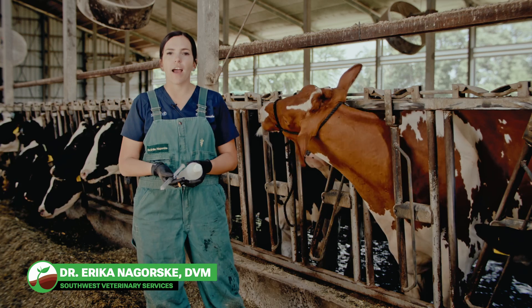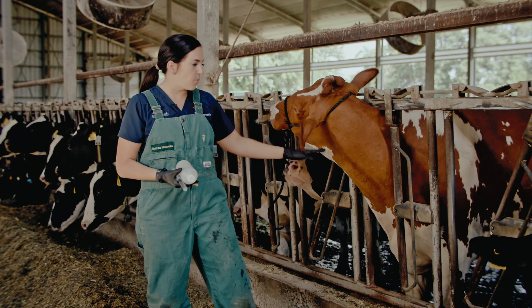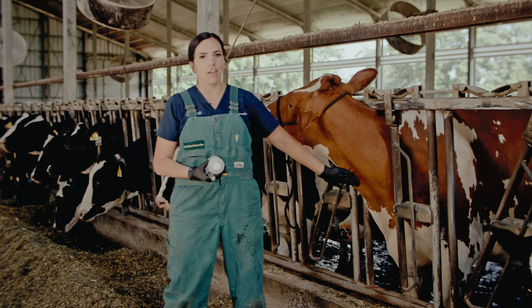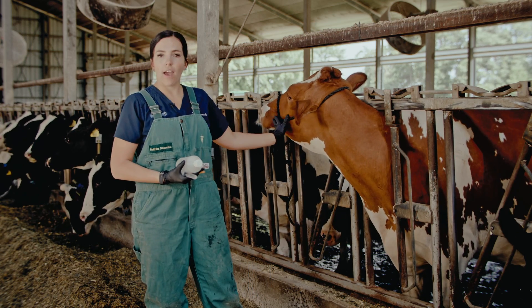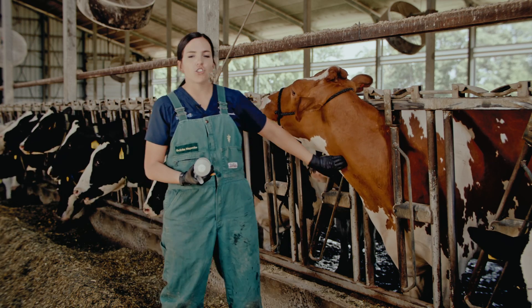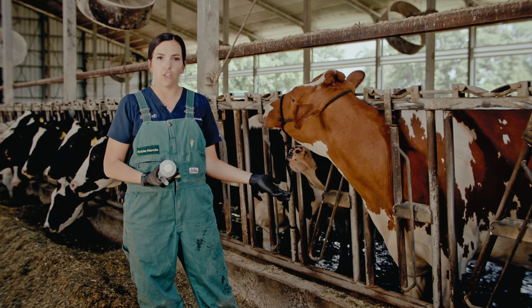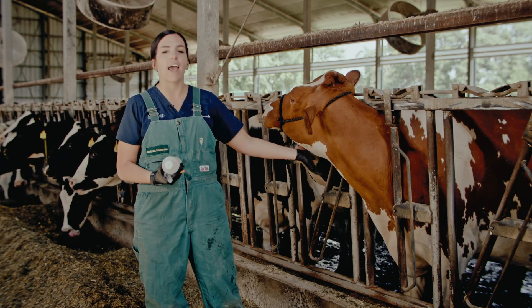Today I'm going to describe how to IV an adult cow. First you need to restrain their head so you can properly access their jugular vein. You can see here this cow has a halter on and her head is tied to the side. You can tie their head either way because they have a jugular on each side of their neck. A chute also works for this procedure but this dairy cow is in a headlock today.